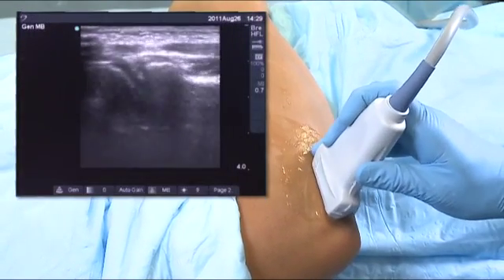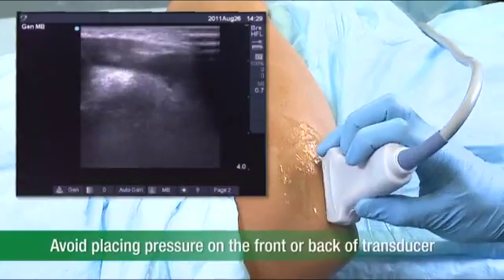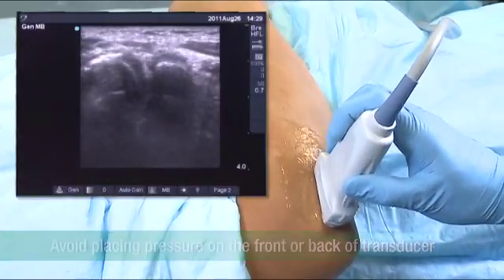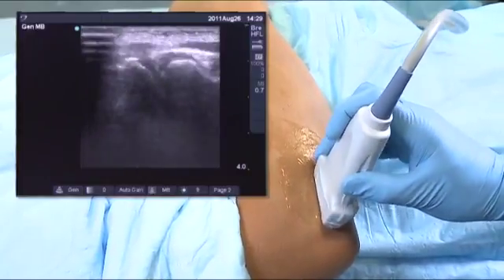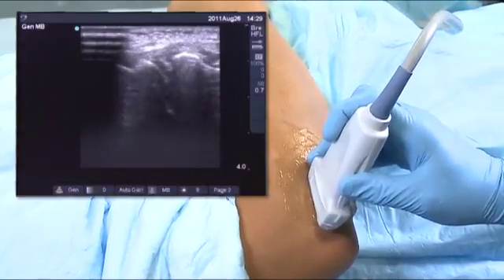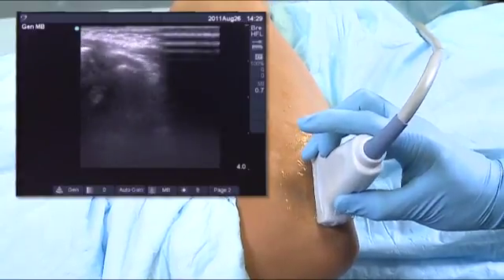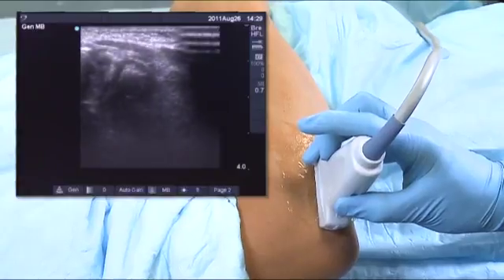The other approach is to not put pressure on the forward or the backward part of the transducer. If you were to do so, you would get some false images of disease, also known as anisotropy. As I'm moving it forward here, I'm getting that darker region on the left side of the screen. If I put pressure on the proximal end, I get some darker regions on the right side, or the distal part.